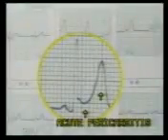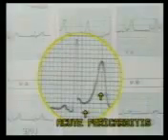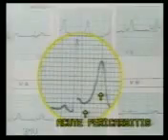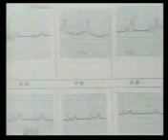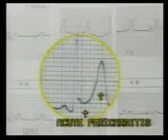The second cause of ST segment elevation is acute pericarditis. This ST elevation is concave upwards with upright T waves. So it mimics hyperacute phase of myocardial infarction, and even clinically the pain is identical. But pericarditis is a diffuse process. So ST segment elevation is seen in all leads, anterior and posterior, and chest and limb leads. Though sometimes all leads may not show ST elevation, causing a confusing picture.